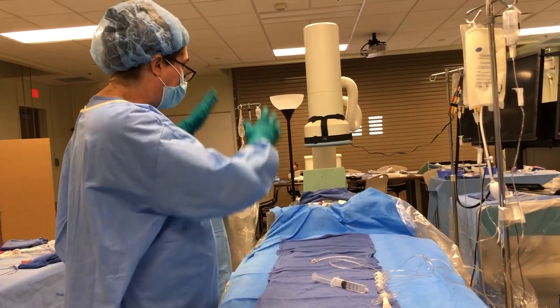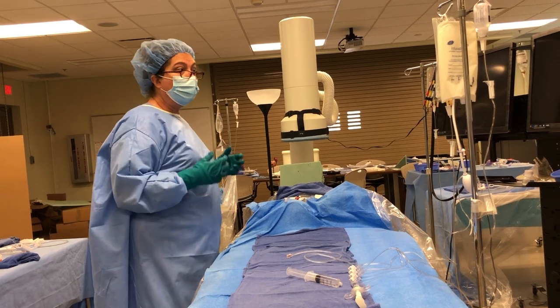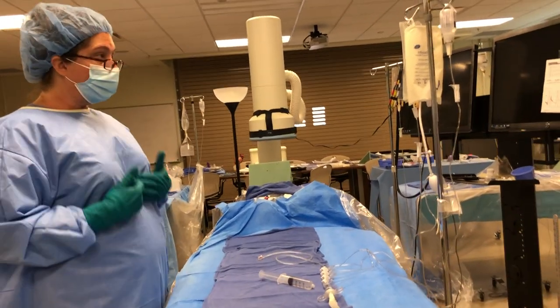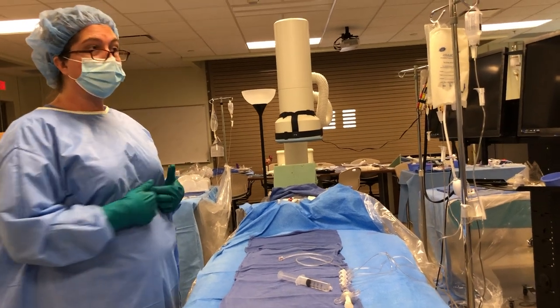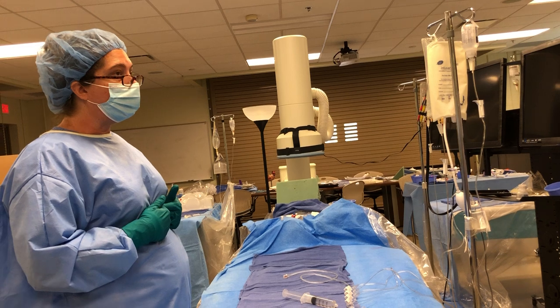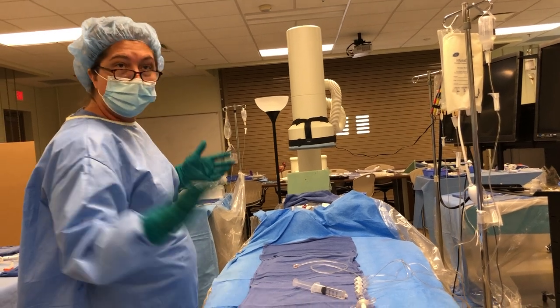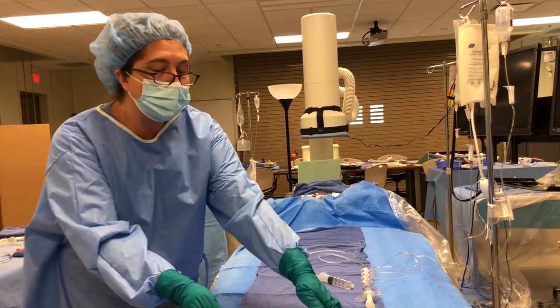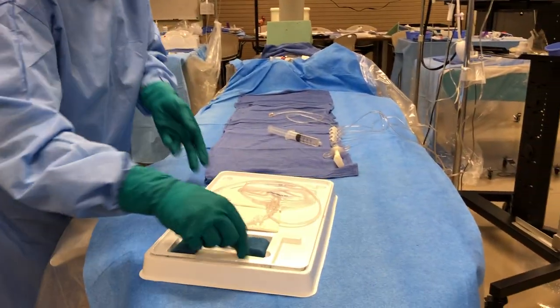Doctors are going to pull back their drape, or if they don't, we're going to have to pull it down to expose this area. Remember, they're going to go sub-xiphoid — that's primarily the spot where they're going to go.